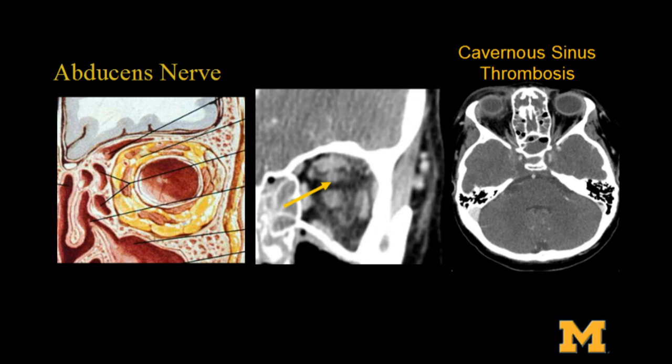It's a very simple study. All the techs are now used to doing CTAs. If you just wait a little longer, you can do your CTV. So there's your cavernous sinus thrombosis.